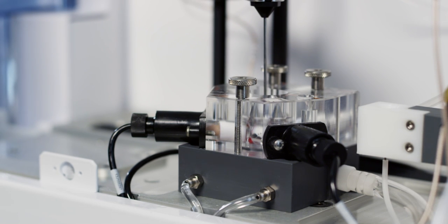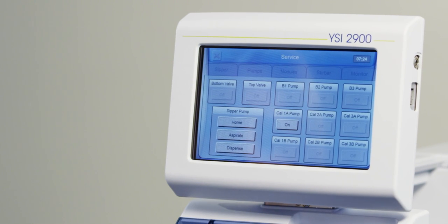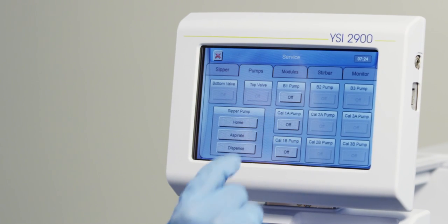To prime the calibrators, turn on the calibrator pumps one at a time. You will know that the fluid has reached the module when you see it bubbling in the calibrator well.